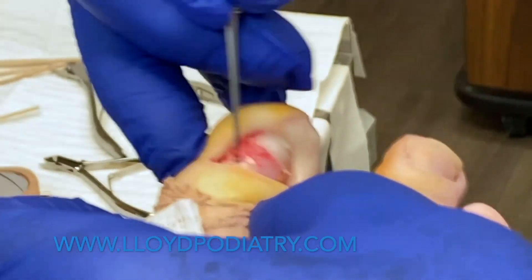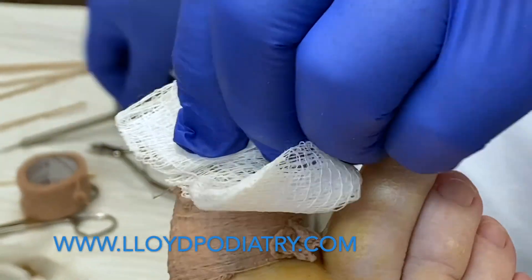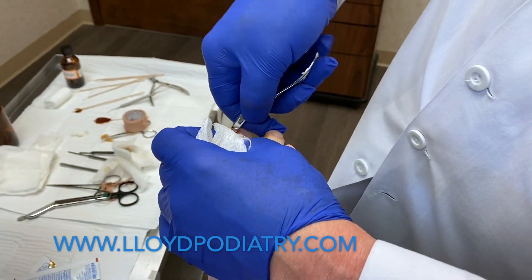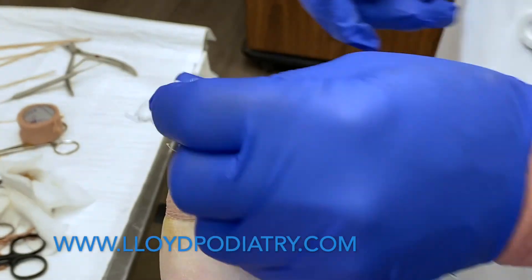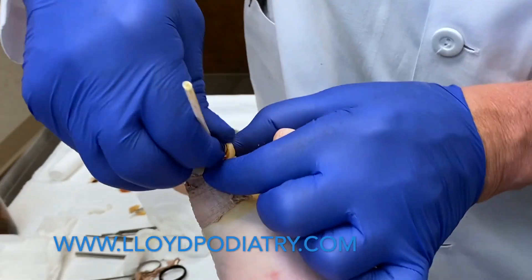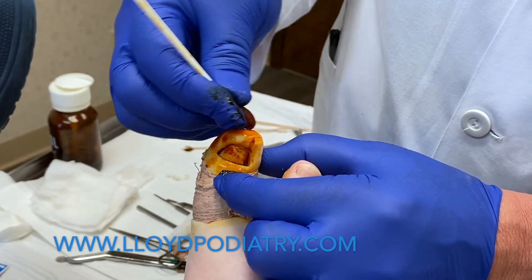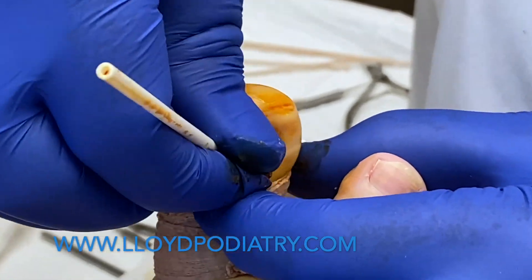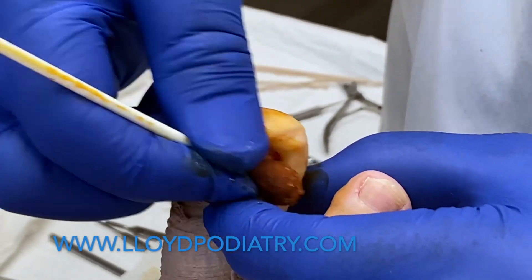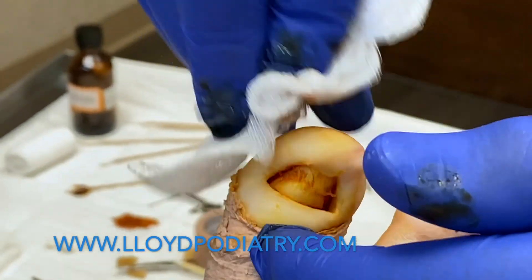Now we'll clean out these margins a little bit and the nail bed, and we're going to put a little medication on here today. This is a little povidone — we're actually going to use this as an antiseptic to kill the germs hiding underneath from the original surgical prep. We find this reduces the infection process. This is something a lot of surgeons don't do; I found it hastens healing so that we have diminished seepage and drainage postoperatively.